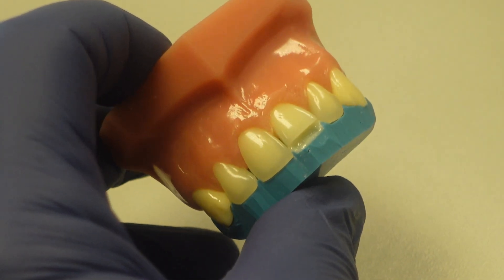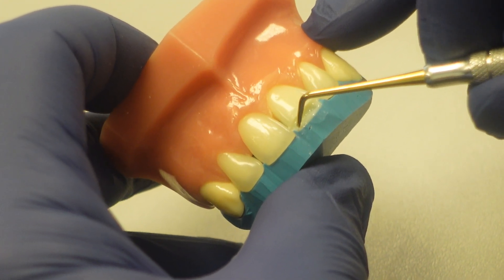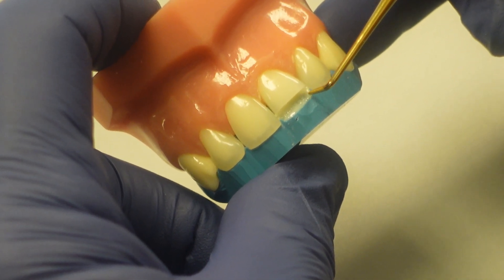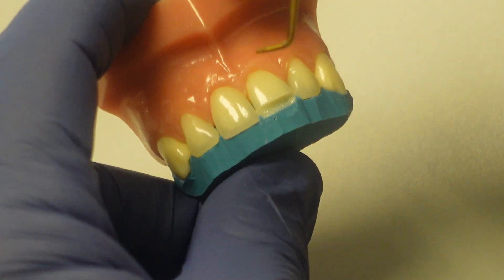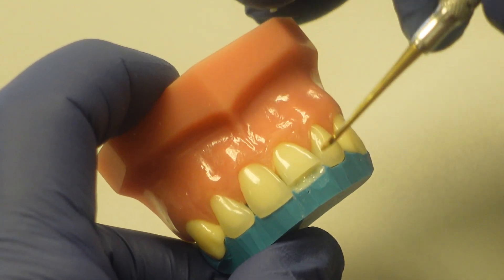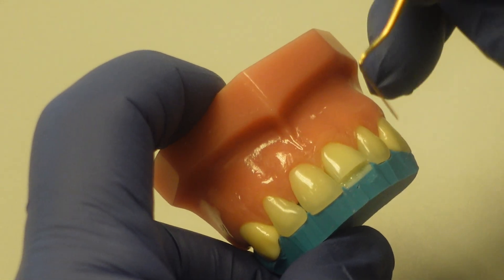I'm also eliminating as much composite as I can right at the proximal. I don't want this lingual layer to form the proximal surface. It might be tempting to leave some of this material in place to save time by forming the proximal surface now, but it's really important to eliminate any material in those proximal areas so it's thin at that point, so that the proximal surface will be formed when you do the final layer — the facial enamel layer.